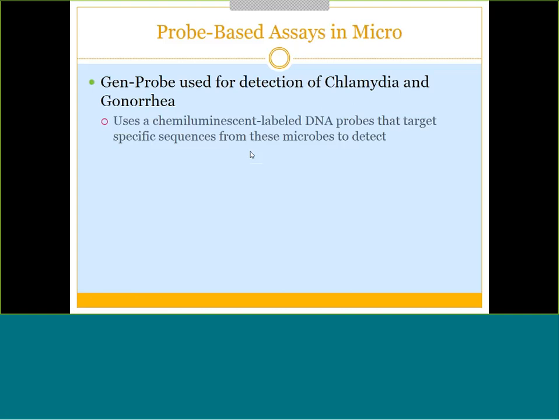So instead of trying to grow it out on the agar plate, test it, they can do this much more quickly than we can. Because remember, in the lab world, we have to grow all those bacteria out, and it takes at least 1 day to grow the bacteria, at least one. Some bacteria take a few days. Some bacteria take 20-some days. It just depends on your bacteria that is going to be there. So it's not a fast, quick process in micro, but with these new molecular techniques, this is all done in an instrument, just looking for DNA. If the DNA sequence is there that they know is related to chlamydia, yeah, you have chlamydia. If it's not, it's negative. It's as simple as that. It doesn't take the day or days like it used to.